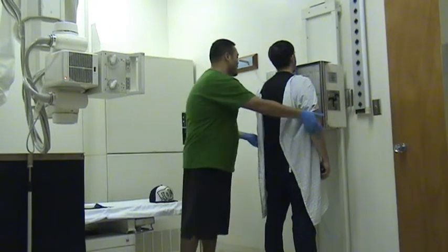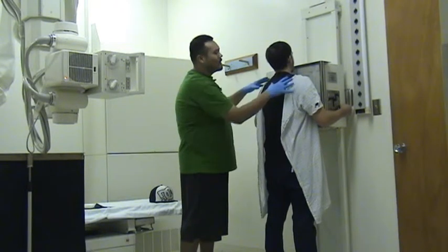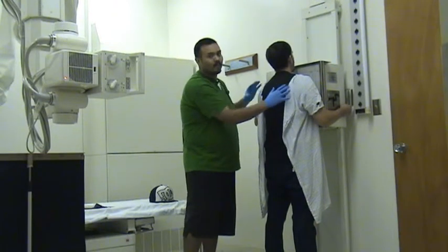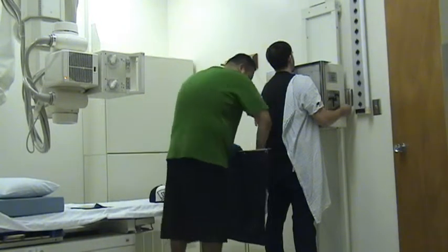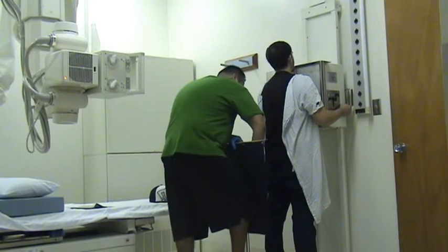Now, sir, go ahead and wrap your arms around the board here. You're going to roll your shoulders inwards. Rolling the shoulders inwards is very important. It'll get the scapulas out of the way, out of the lung field, and give you a full clear shot. I'm going to place a lead shield behind your back. Please do not take a step back. You might trip.